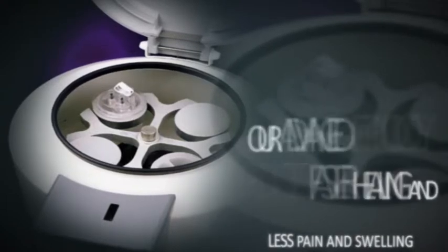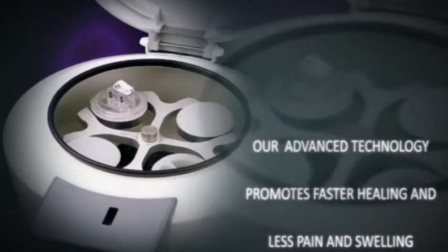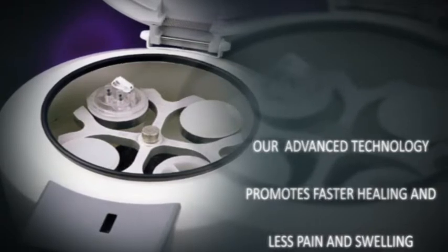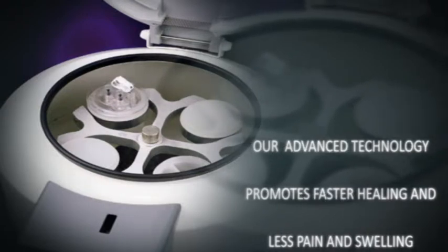Some of the patient's hip bone was harvested to be transferred to the upper jaw. The bone harvested from the hip is the gold standard for bone grafting. Unlike alternatives such as human donor bone or animal bone, using your own bone gives peace of mind in not getting infectious diseases, no matter how remote the possibility. Furthermore, the bone is fresh and is able to stimulate more bone cells to form.